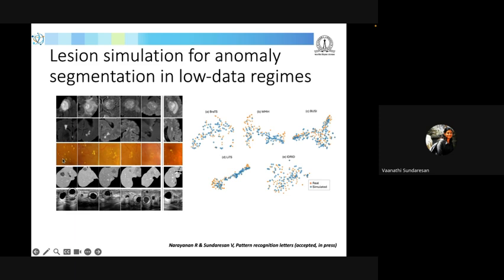And these are exudates, which are early signs of diabetic retinopathy. Here we generate the lesions on retinal images, and we can see them from high contrast to low contrast. And the liver tumors, where we generate tumors of different contrast. And finally breast ultrasound tumors. These malignant tumors, the circled ones, are the simulated ones, whereas the real one looks like this. So we also wanted to see, similar to the t-SNE plot that I was showing before for microbleeds versus mimics, how close in characteristics the real and simulated lesions are.